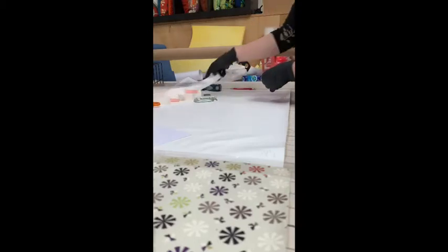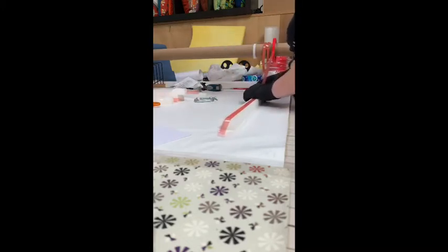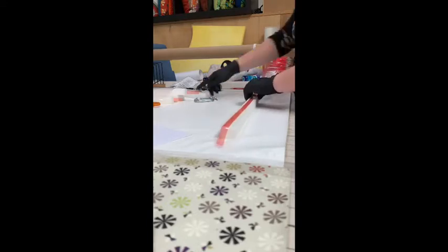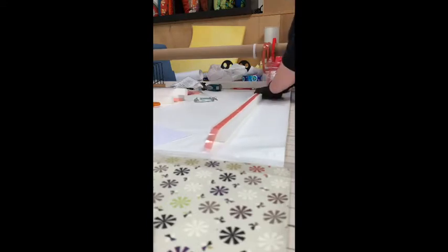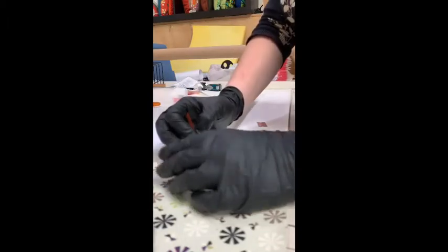Alright, so step one in the shield making process is that you're going to take a roll of industrial strength double-sided tape and center it on your custom cut pieces of foam. We had these custom cut to 1 by 1 by 8 inch, and I'm going to do it in a line. This would be the first step in an assembly line, and I'm doing it in a line because it makes it more efficient when peeling off the second layer of protective plastic.